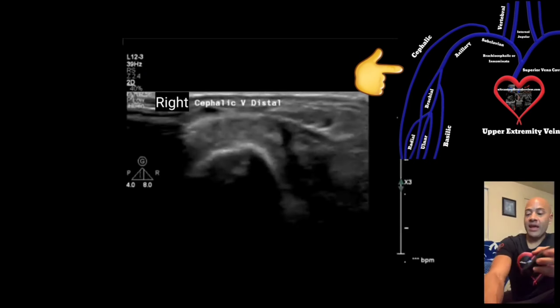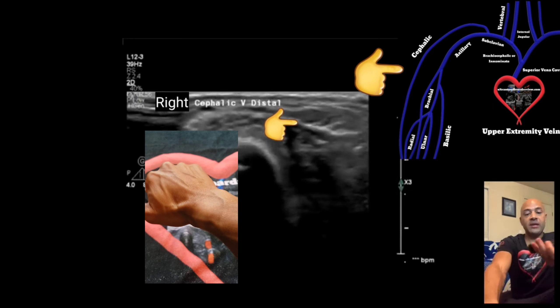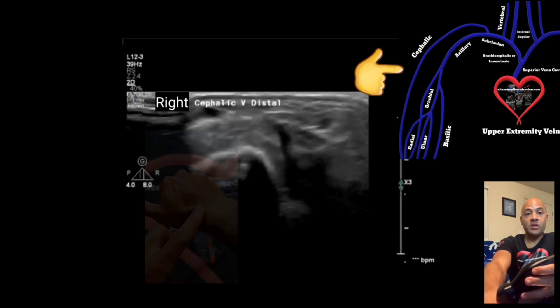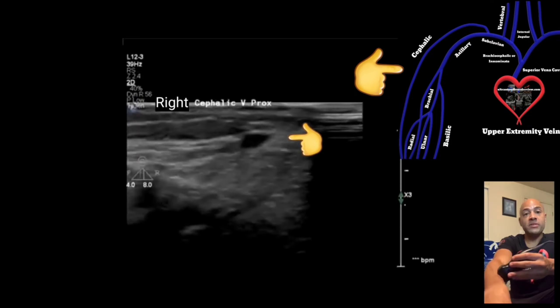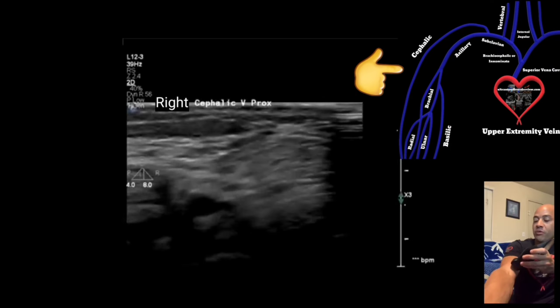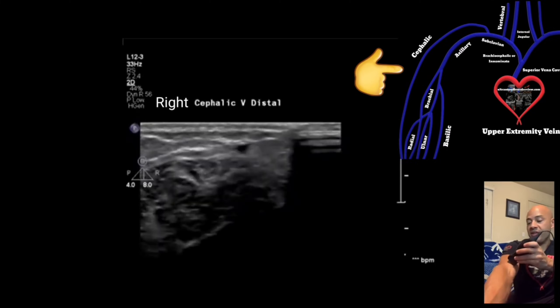Finally, we're going to look at the cephalic vein. Start at the back side of the patient's wrist with the patient's hand pronated, and keep the transducer in the transverse view. Acquire an image compressing the cephalic vein. Then move to the mid forearm and acquire an image there. Repeat those steps for the proximal forearm cephalic vein.